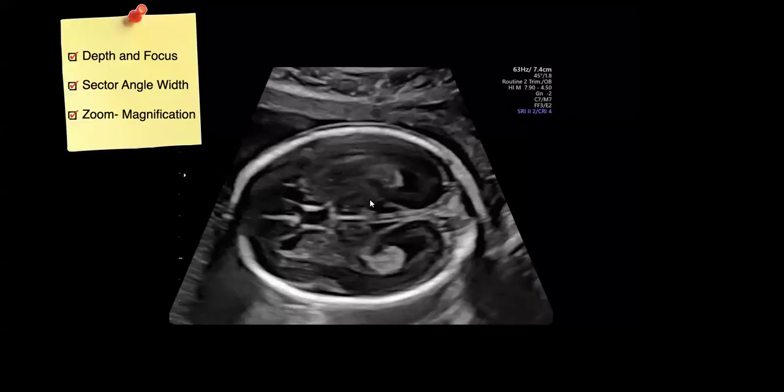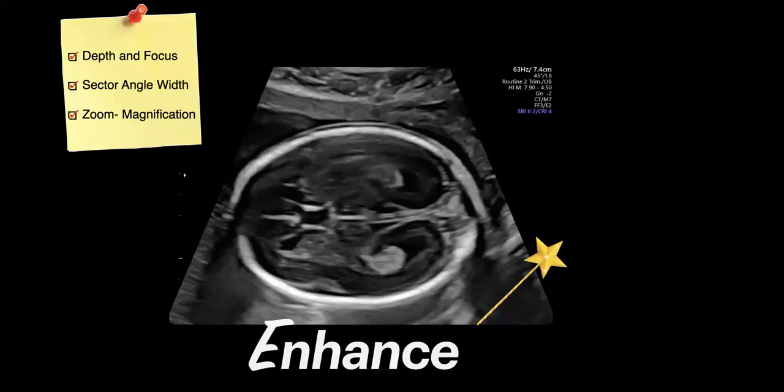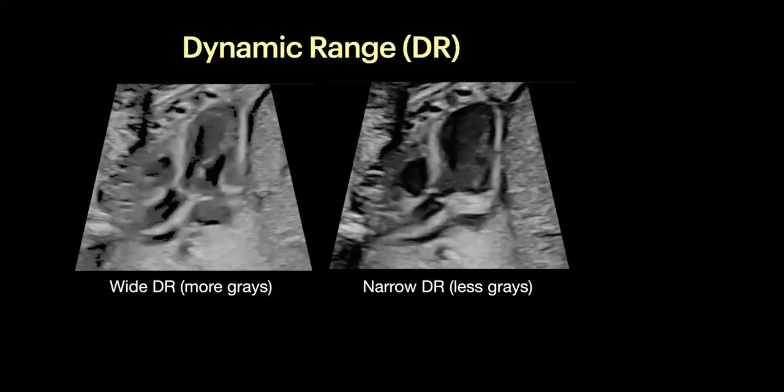But what else can we do to further optimize our next image? Well, I call this last step enhance. And enhance, by definition, is to improve or further improve the quality of your image. And this is done by making small adjustments with the current settings that do exist on all your ultrasound machines. And that one is of your dynamic range.